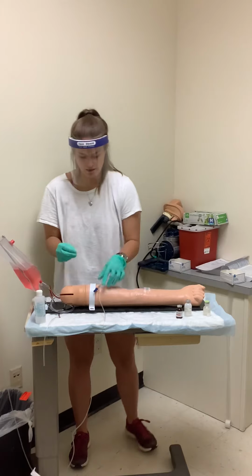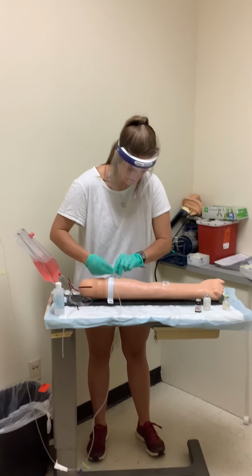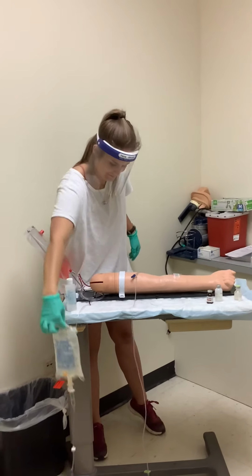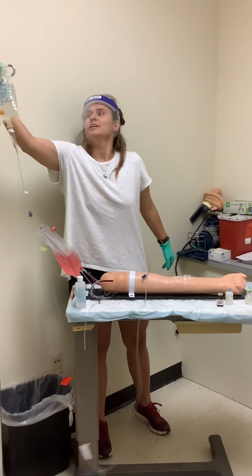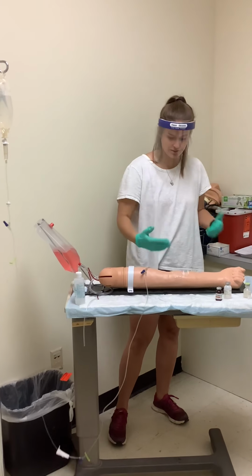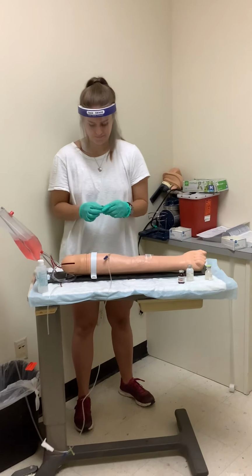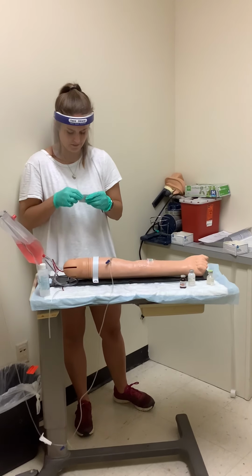Now I'm going to scrub the hub for 15 to 30 seconds. But before I do that, I want to make sure that my line is patent. The drop, looking for blood return, which is good. Checking the site for any sort of infiltration, redness, edema, swelling, warmth. Everything looks good. And now I can get another alcohol pad and scrub the hub for 15 to 30 seconds.